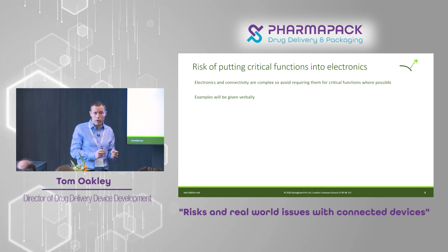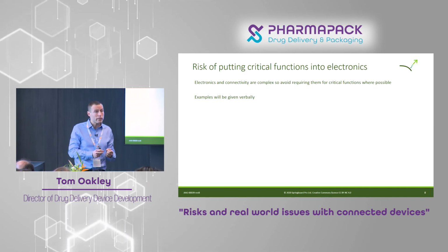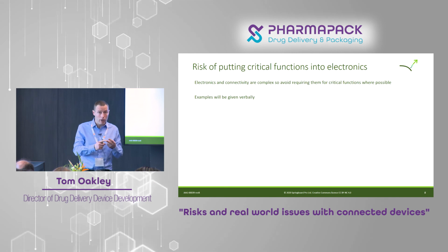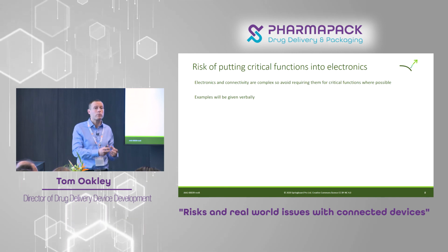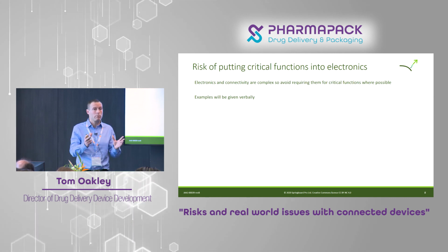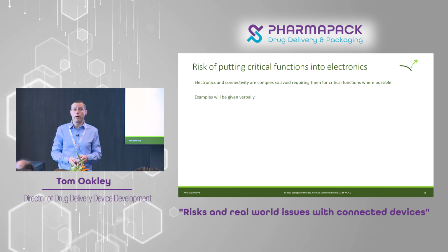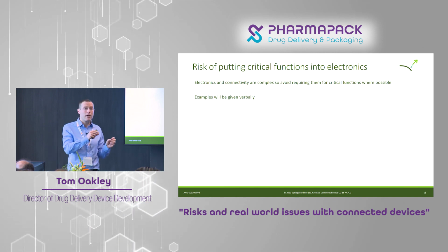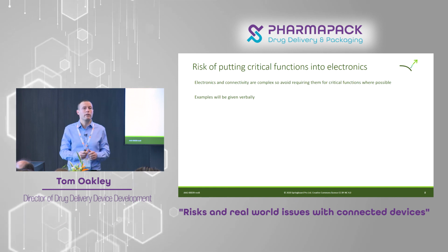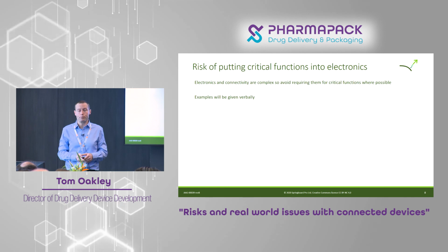So if anything goes wrong, you've just lost the critical functions of your device. And in practice, what happened was they had LCD problems and battery problems. And they are now critical problems where the device had issues with supply on the market because they had to recall some batches and so on. So that's a real-world example where that was a real problem. If they had added the memory aids separately in some way, they would have avoided causing that issue with the critical functions of their device.